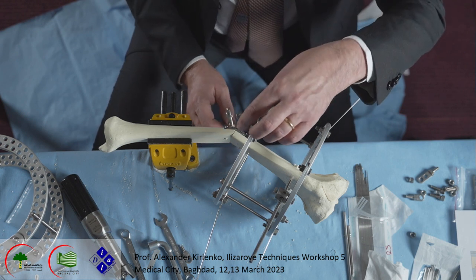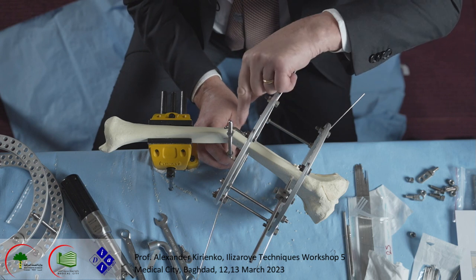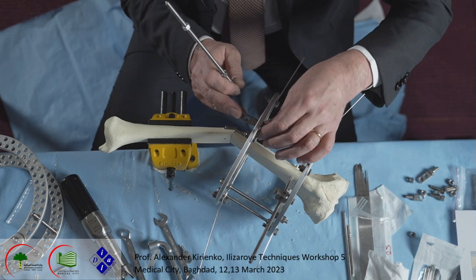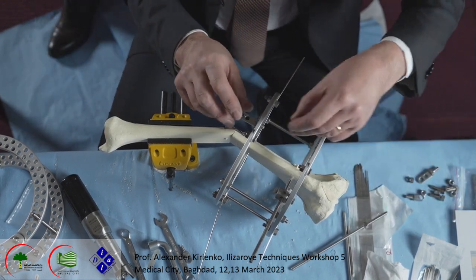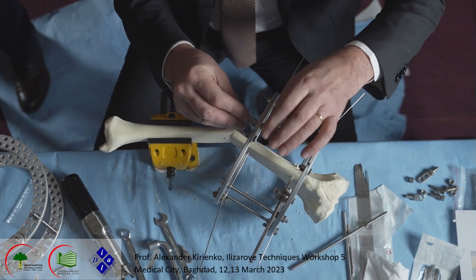Because if I put it medially, when I do correction the lateral part will be compressed, so it should be built here. In this way, when I do correction, it will create triangular or trapezoid regenerated bone. Okay, I put the hinge here.